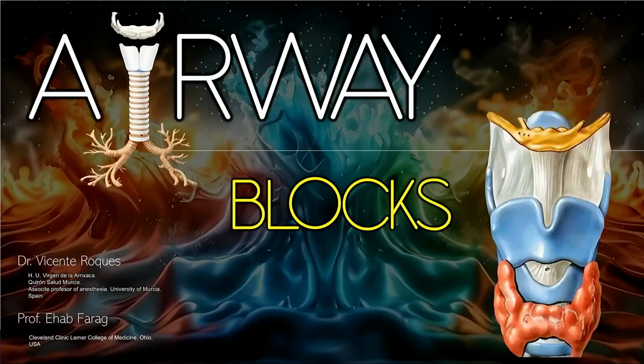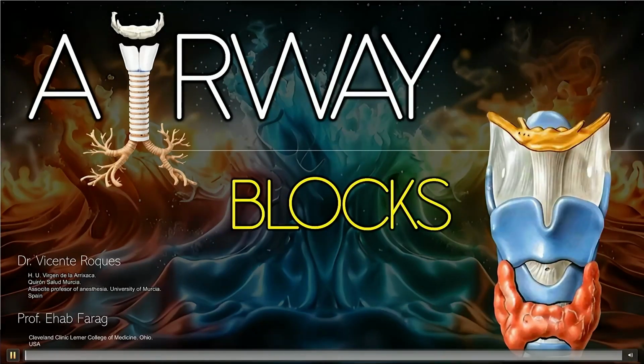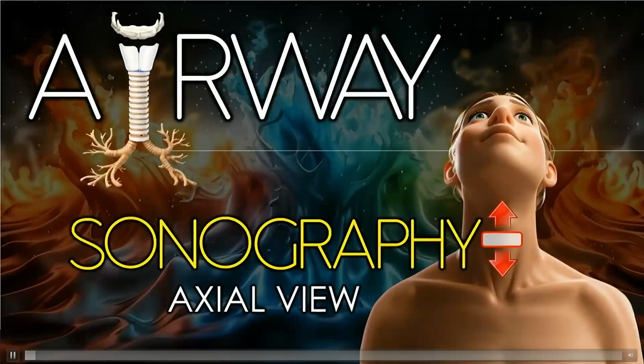I'm going to show you a video to summarize ultrasound-guided airway blocks, sonography and techniques. The axial ultrasound assessment of the airway begins with the patient in a supine position, with the neck slightly extended to optimize visualization.